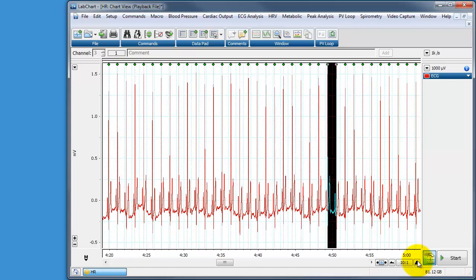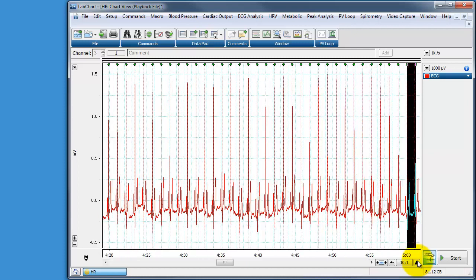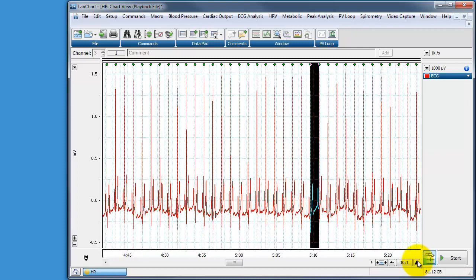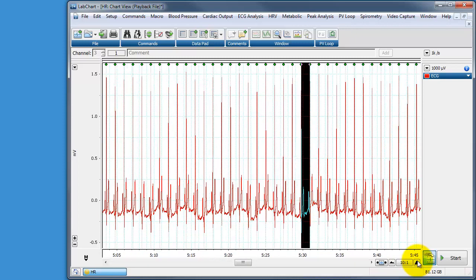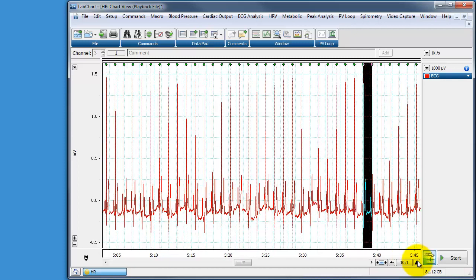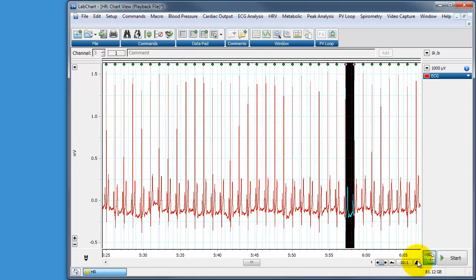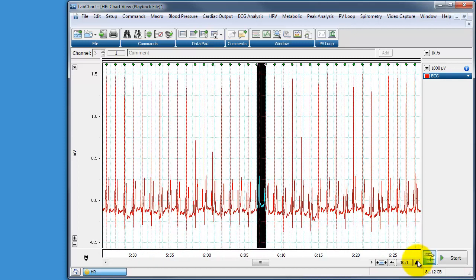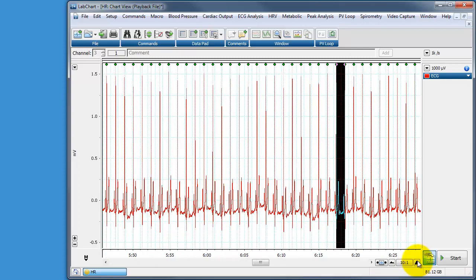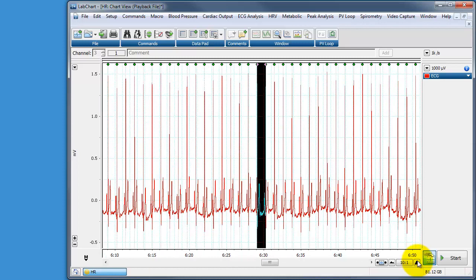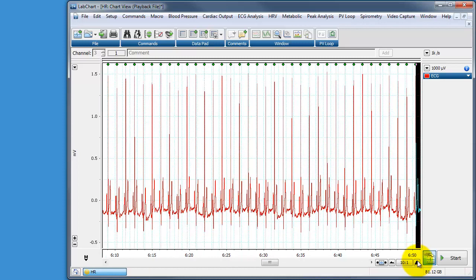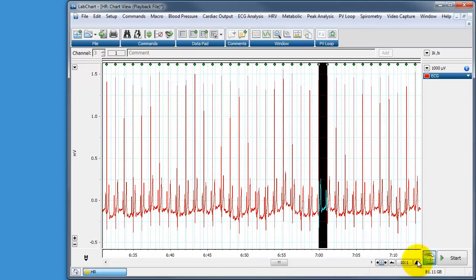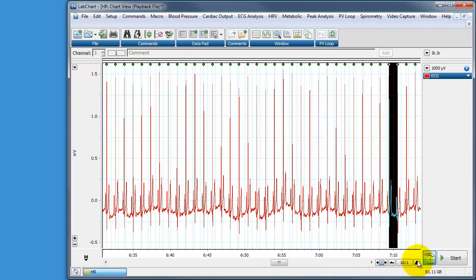So I'm just going to sit here and watch this on the screen as it plods through. You can see it's pretty good. It hasn't missed any r waves yet. This is a particularly clean ECG. You'd have to play with your threshold values to make sure this worked for your application. Obviously you could not be looking at ECG. You could be looking at anything.